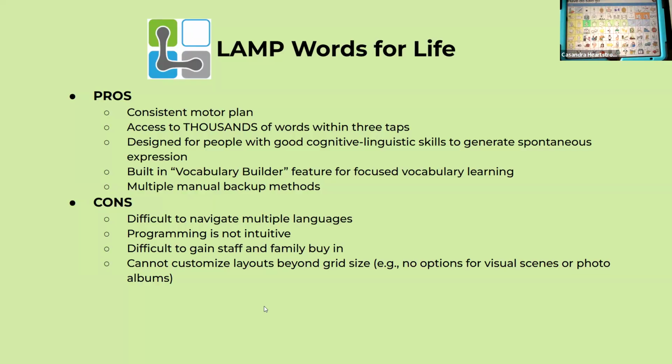I just selected go, and that's what's on our go page. Whereas in the full version, when I touch go, I have all of these other options too. So there is a method to the madness.